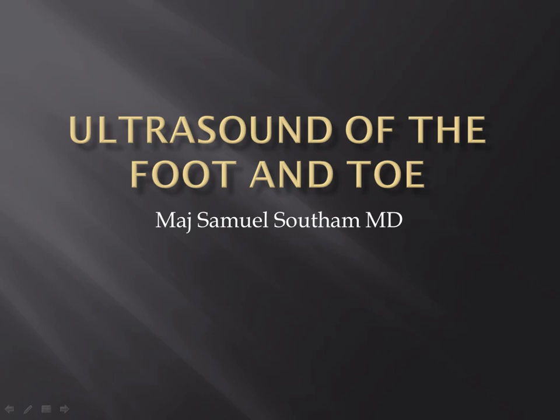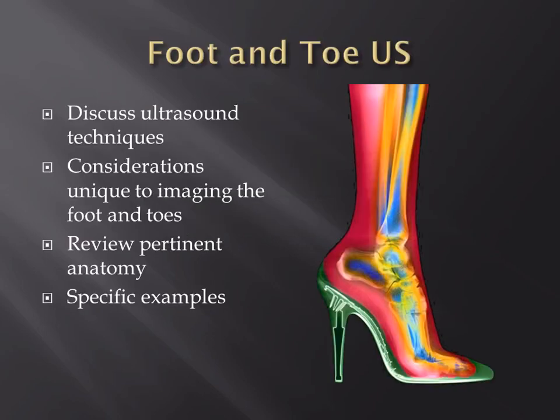So there will be a couple of things that will be redundant in my talk regarding the foot, but not too much. I'm going to, again, like all the other lectures, talk about some of the ultrasound techniques, considerations unique to imaging the foot and the toe, some pertinent anatomy, and spend some time with specific examples.